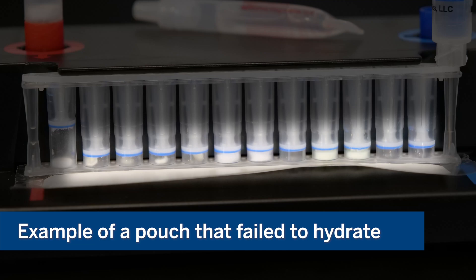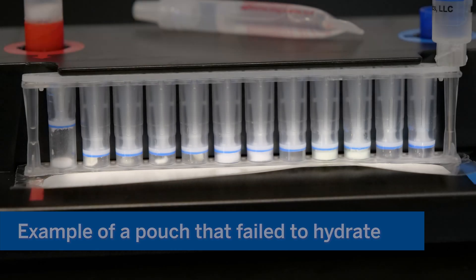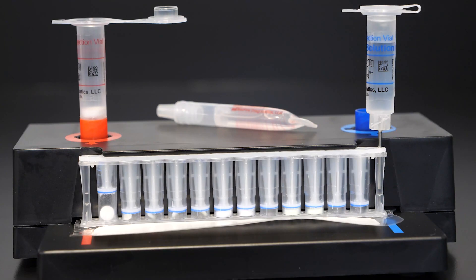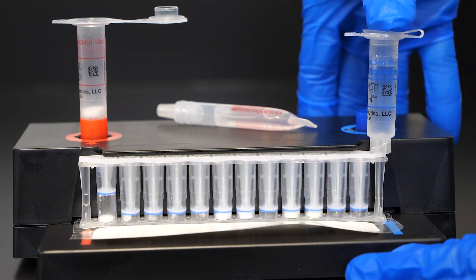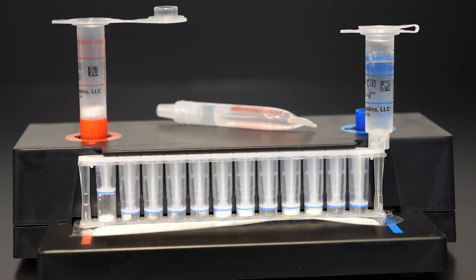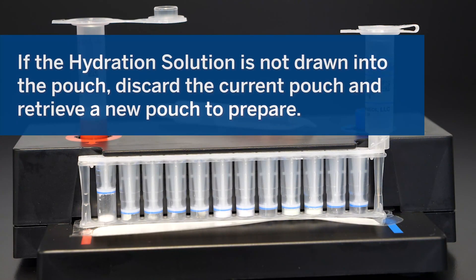If the pouch fails to hydrate and the reagents still appear to be dry white pellets, attempt to rehydrate the pouch by pushing down on the hydration injection vial to verify that the seal of the pouch hydration port was broken. If the hydration solution is still not drawn into the pouch, discard the current pouch and retrieve a new pouch to prepare.